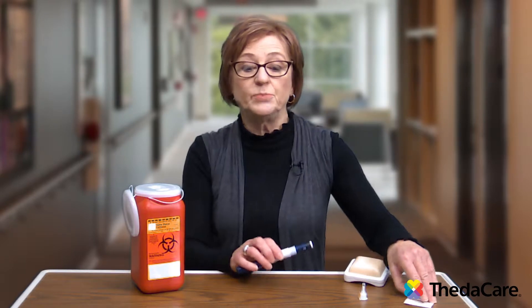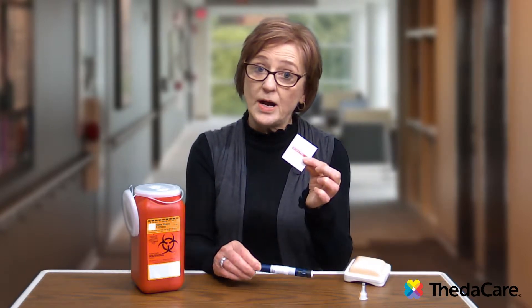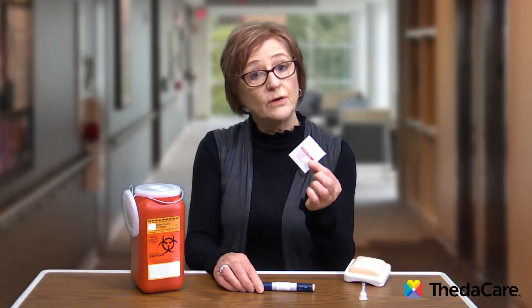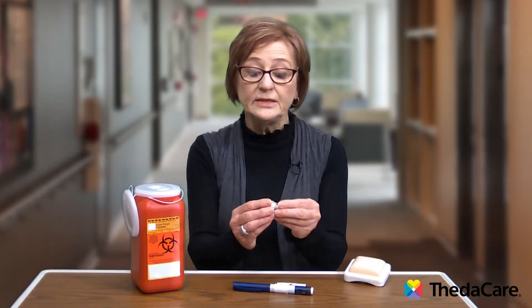To prepare for your injection, first you want to make sure that your hands are clean, so wash your hands first. Then get your supplies ready. The supplies you will need are your insulin pen, an alcohol swab — or rubbing alcohol with a cotton ball — and a new needle for each injection.